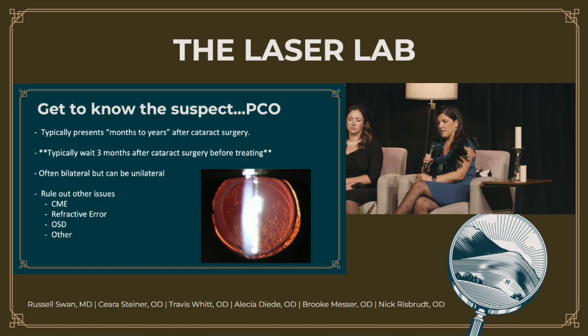I'm also looking inside the eye just to make sure that there's no reason I can't do it. So I'd be looking for inflammation, maybe some retina findings, anything that would cause some disruption or tugging on the vitreous that could cause some issues with the retina. So basically in the back of the eye, I just want to see a stable eye that we saw before cataract surgery, and then checking for anything related to potential retinal complications or inflammation.